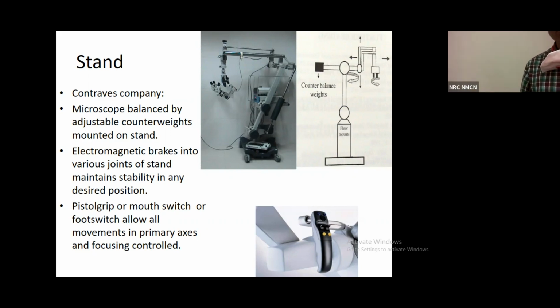We want to operate upon a patient. Even if you are operating 2 times a day, we still have to balance the microscope 2 times a day. So what the microscope does is it redistributes the weight along this stand, so that the stand and the optical part of it feels relatively weightless.